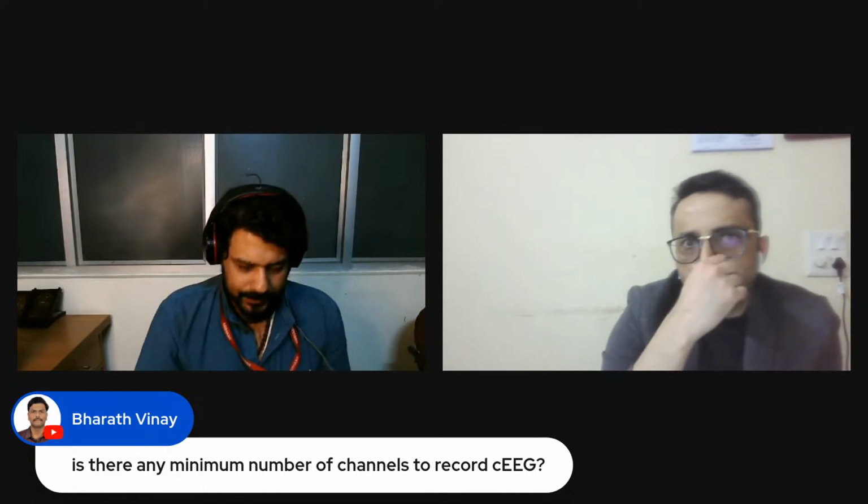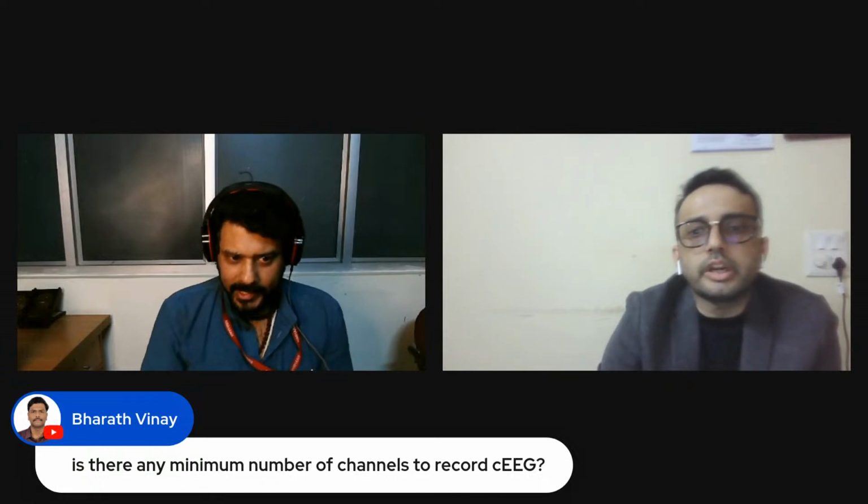Okay. Yes, sir. So Bharat is asking, is there any minimum number of channels to record continuous EEG? Sir, yes, sir. We should include all the bipolar longitudinal channels. Yes, basically, sir, 19, 21 channels total. Yes, sir. 21. Right, sir. 21. Okay.